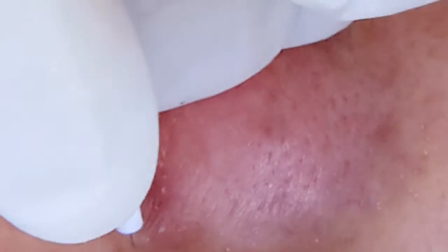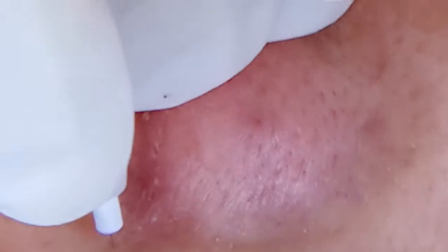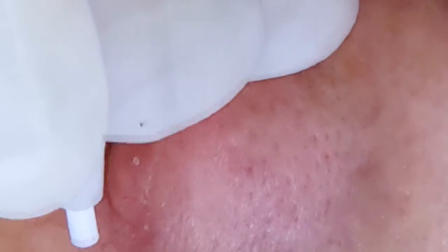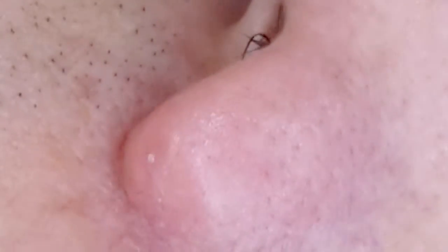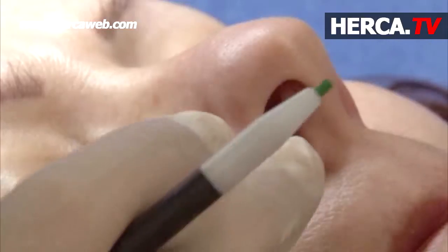Good. Good. Your pressure is perfect, your angle is great. Good. Good. Here it takes the skip. Okay, do this one.